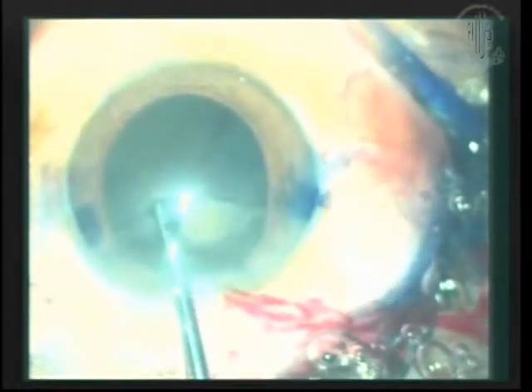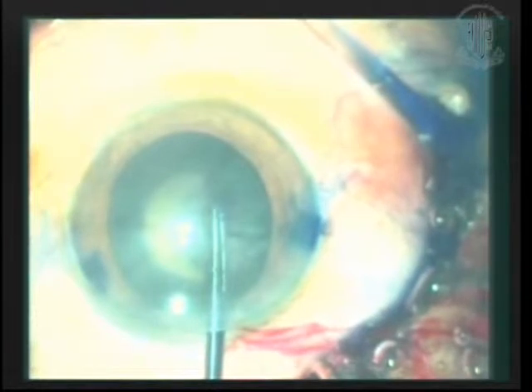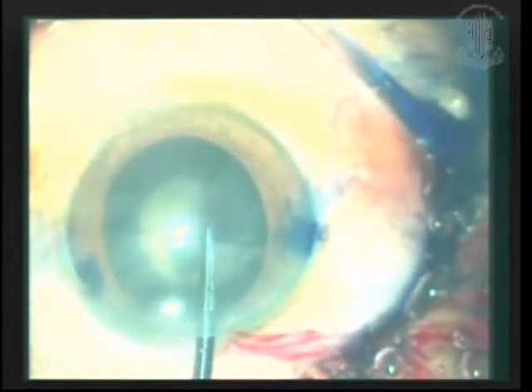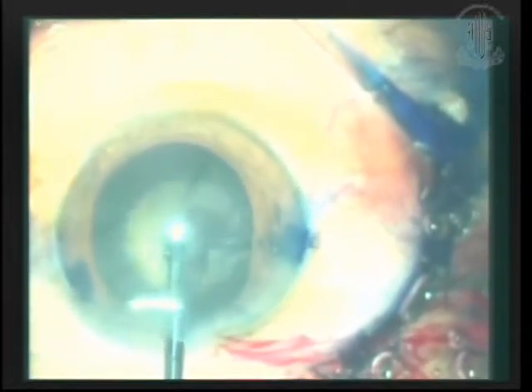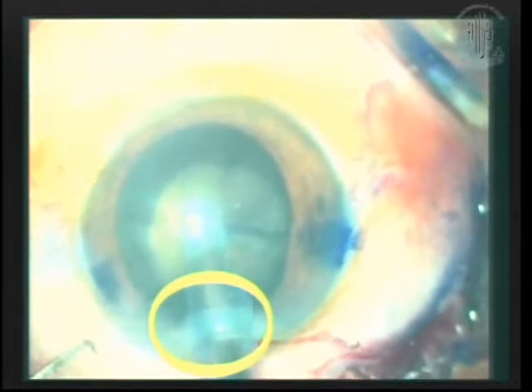If you can see, this is Dr. Haldipurkar's rexis forceps, a wonderful device. If you've not used it, you must try it. It gives you absolute control on a capsular rexis in this situation. Now, to stabilize the lens, I put in a bit of Healon, and I just left it over there by oversight, and you see what happens. The moment I impale the nucleus with a bit more energy, I am having a wound burn over here.